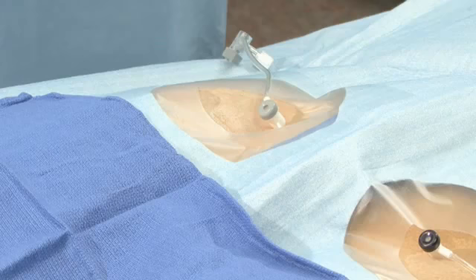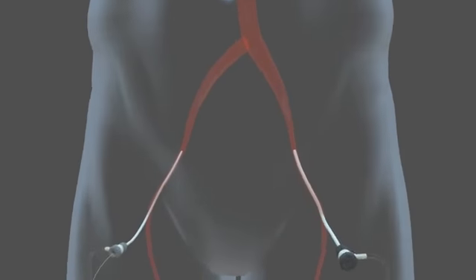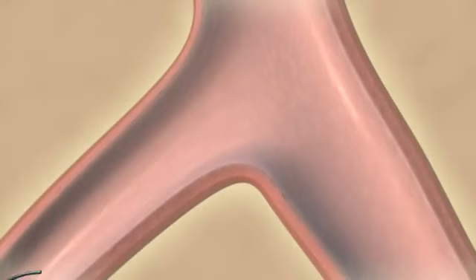To capture a wire over the aortic bifurcation, access both femoral arteries. Next, introduce a wire through the sheath and into the ipsilateral femoral artery. Advance the wire to the aortic bifurcation.